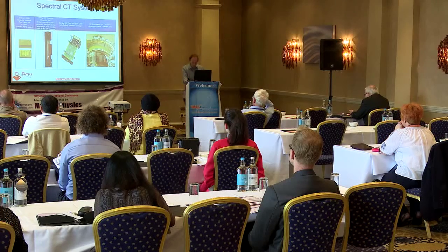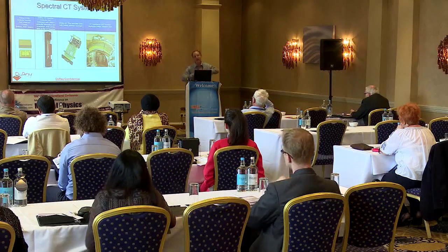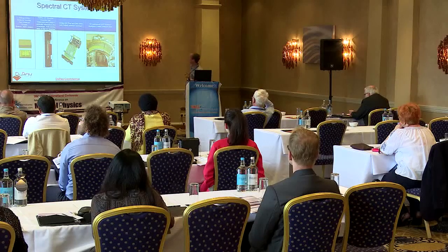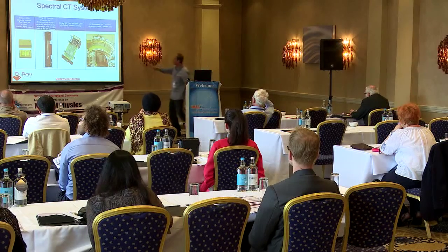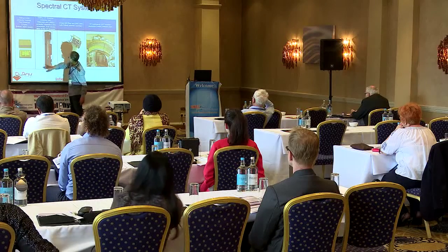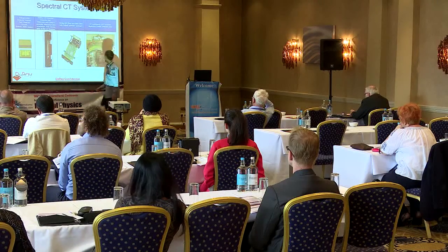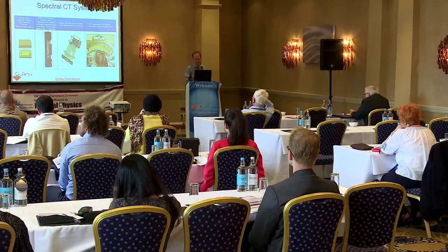And so this module was used to populate a GE Lightspeed system to create the world's first full photon counting spectral CT system to image patients. The final module that was built is here on an aluminum bar, which was designed to be the same shape as the substrate that held the previous integrating detectors that are normally used, so that they can snap into place into the conventional CT gantries that are used.